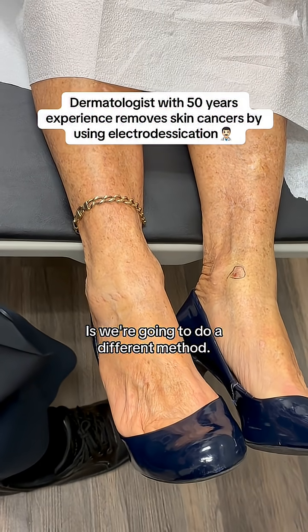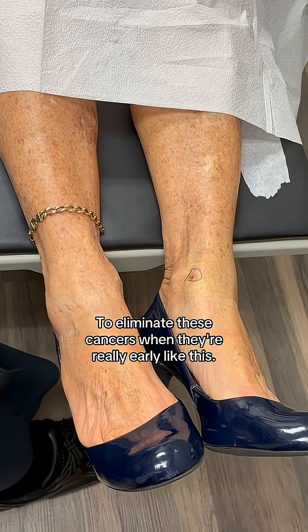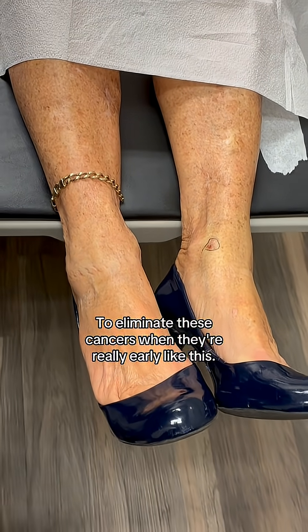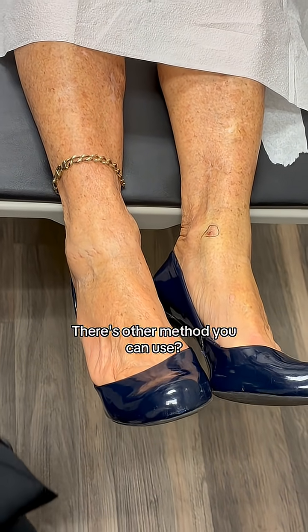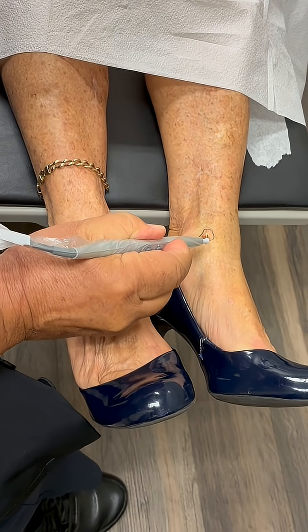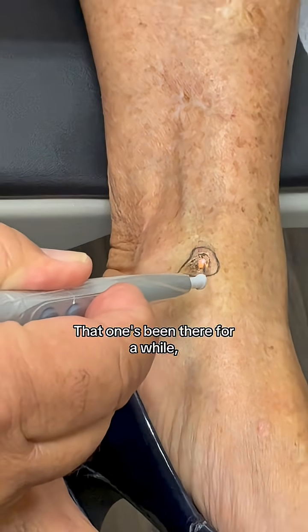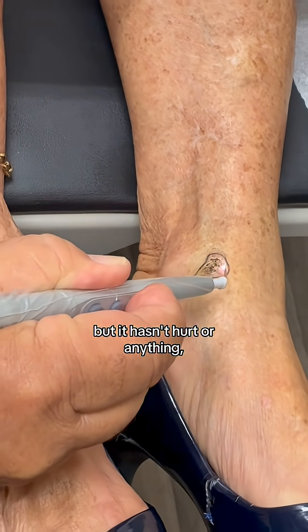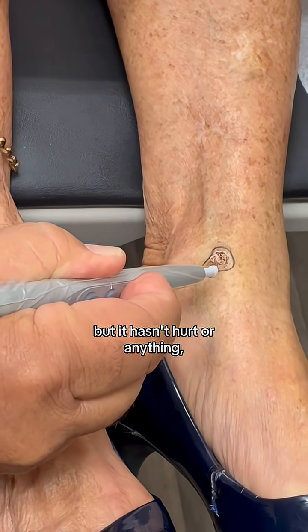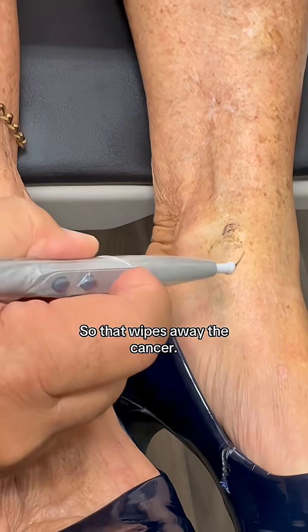We're going to do a different method called electrodesiccation to eliminate these cancers. When they're really early like this, there are other methods you can use — that wipes away the cancer.